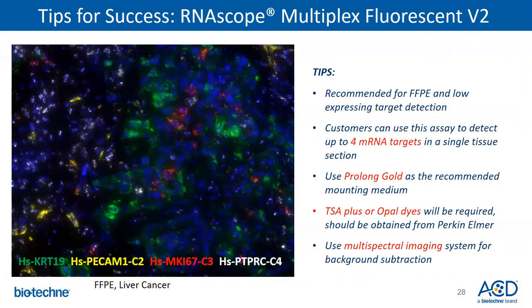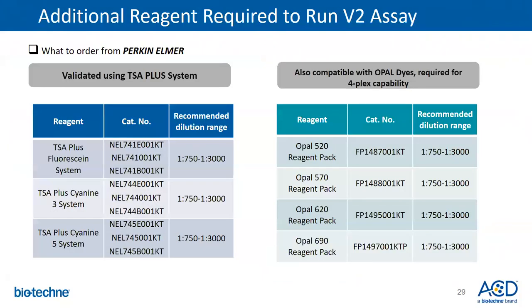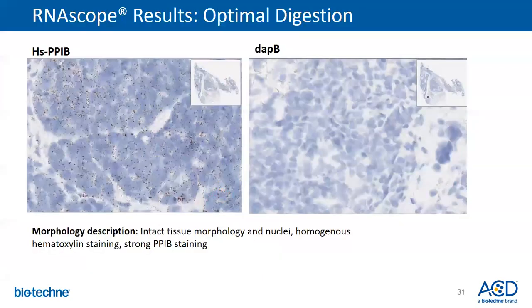This is what some of that data looks like. I'm going to speed up a little bit just because of time. Okay, so I mentioned the pretreatment portion of the assay. This is where you might need to mess with it a little bit in terms of timing, depending on what your sample is. So this is what an optimal digestion looks like, the balance between over-digesting and under-digesting.